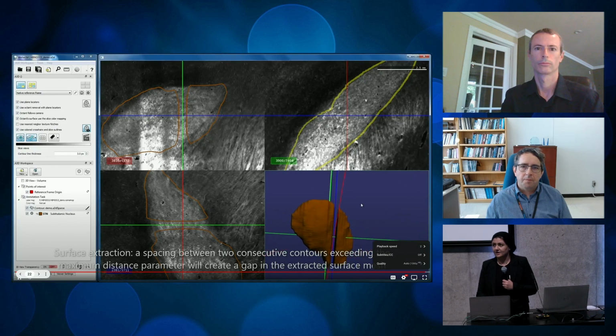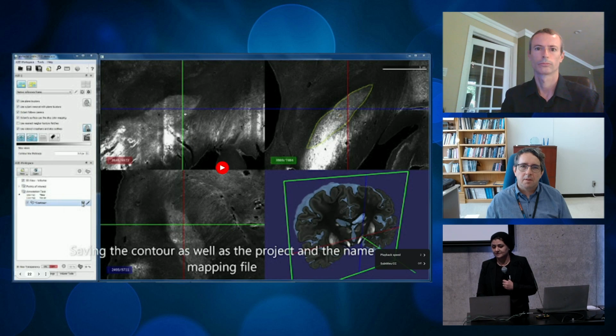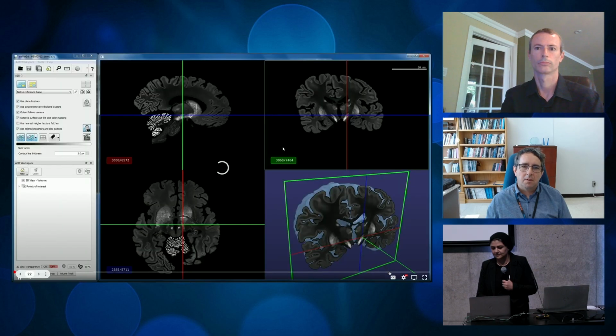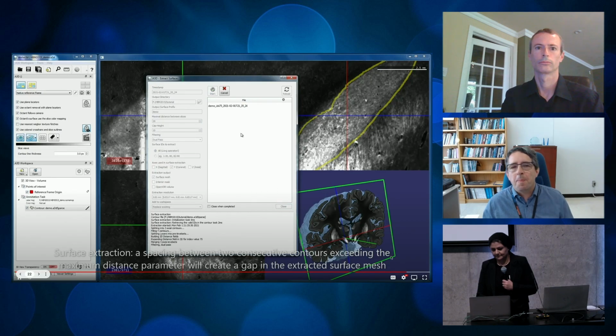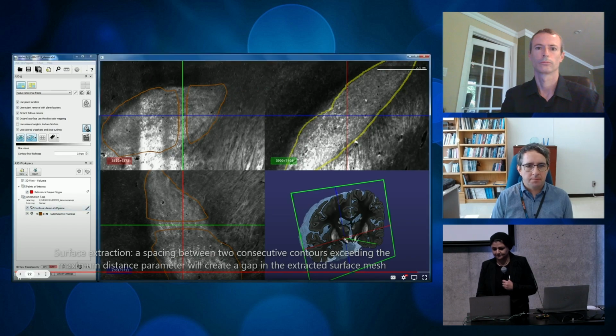And this is where I told you that the distance between the painted slices shouldn't be more than the predefined number of slices. For example, here we defined it as 20. When the distance is more than that, it creates two different 3D meshes.